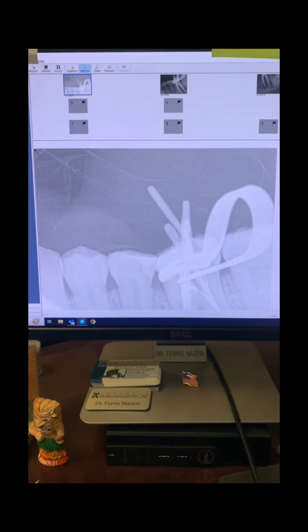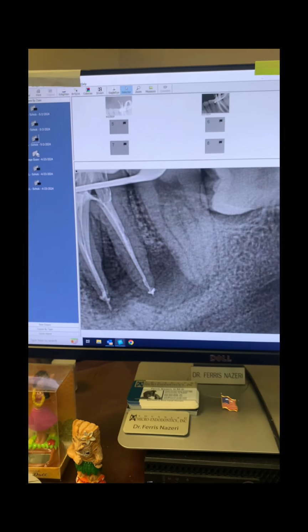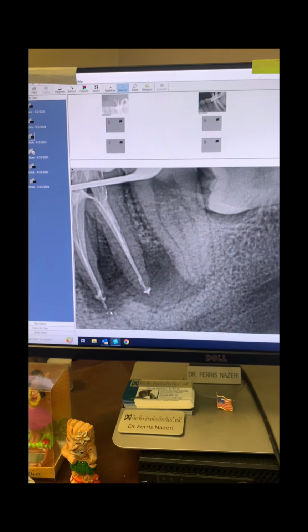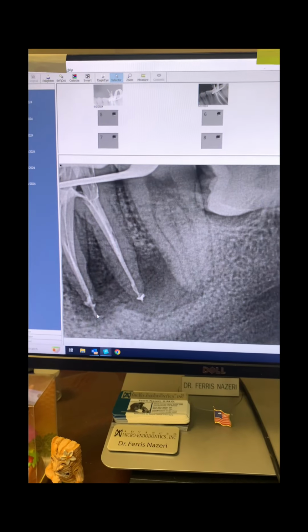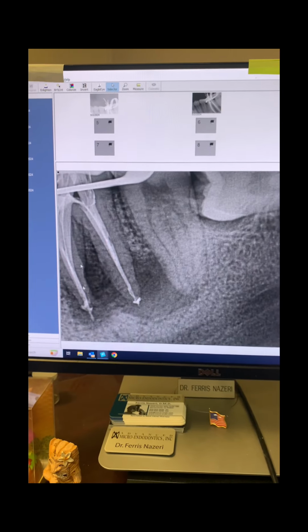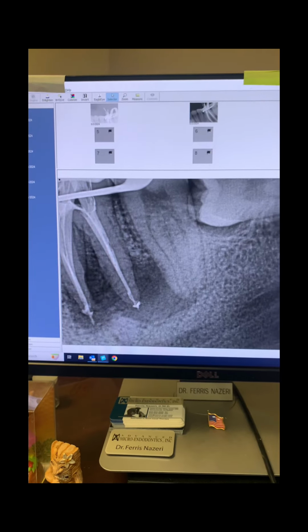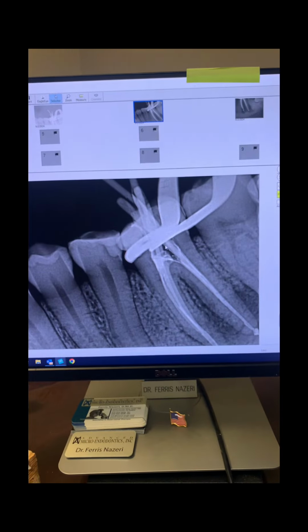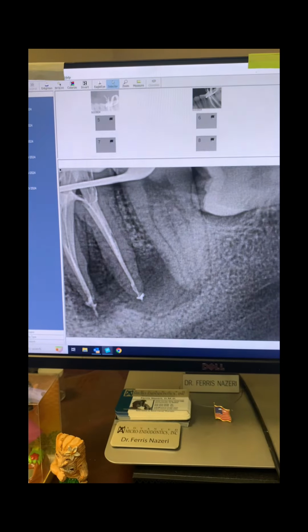All right, so my working length was 25 millimeters. So I just wanted to take an x-ray just to make sure. And as you can see here in the mesiobuccal, I was long about 2 millimeters. So I corrected that and removed the gutta percha and cut it by 2 millimeters. We couldn't get this angulation here, but in this shot we were able to get it right there.